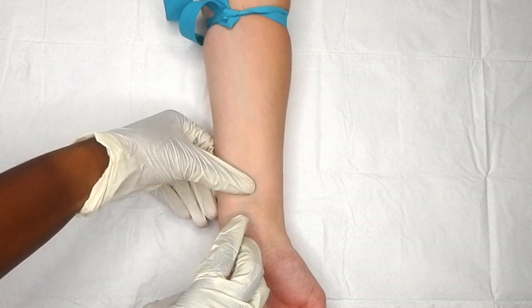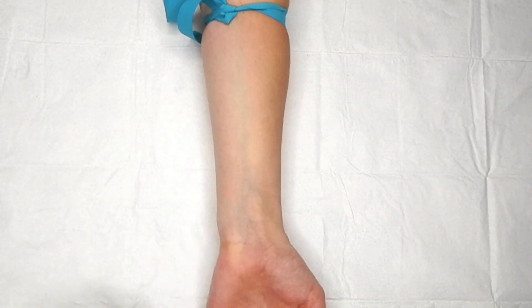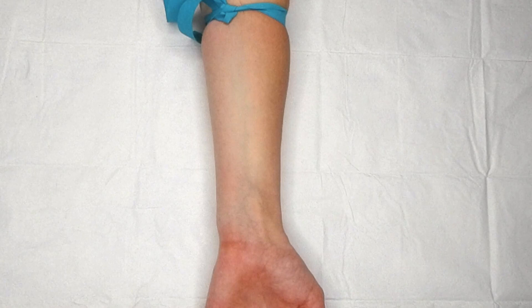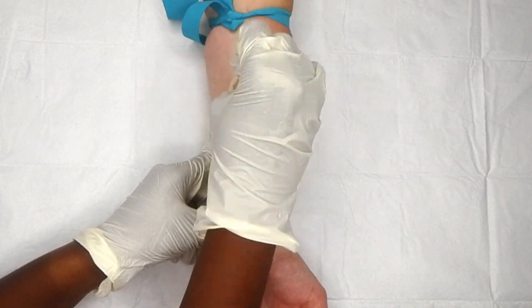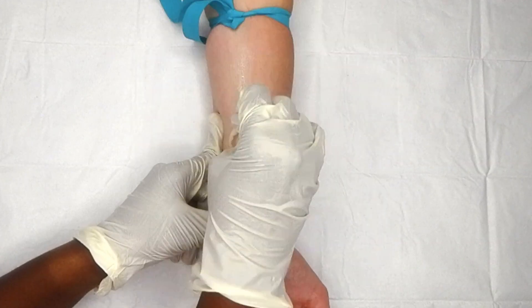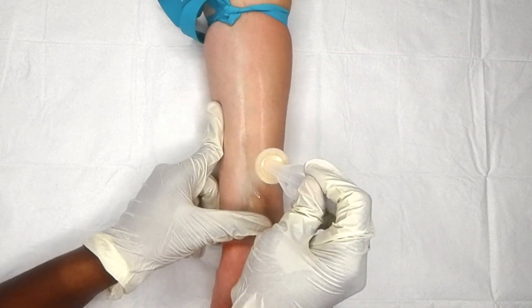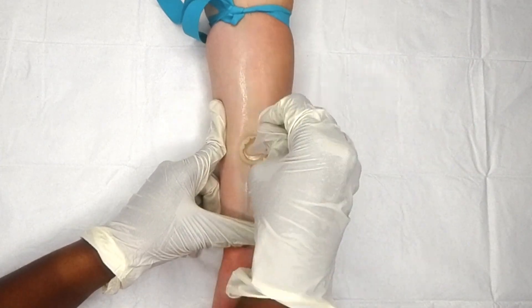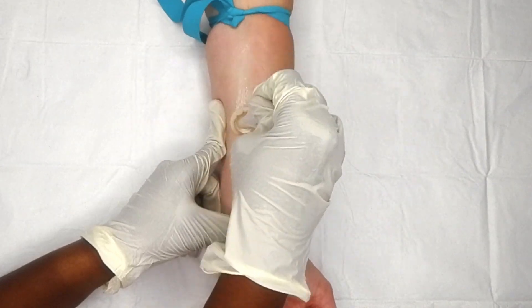I love this particular vein because of its location — normally found in the middle of the forearm. This location is great for when IV therapy is needed for multiple days. It's also a prime location because it's away from any point of flexion like the wrist or the elbow, which gives the patient more freedom to move and actually ensures that your IV lasts much longer.